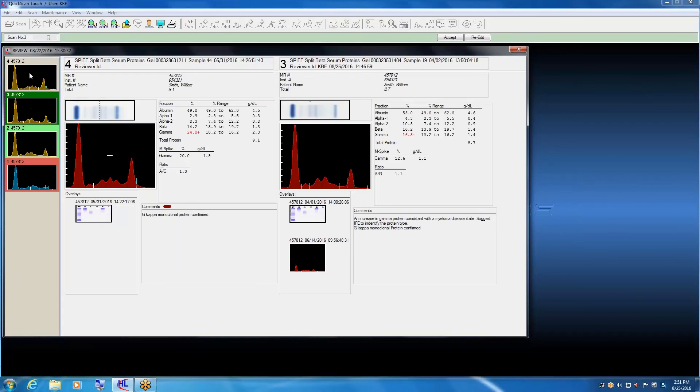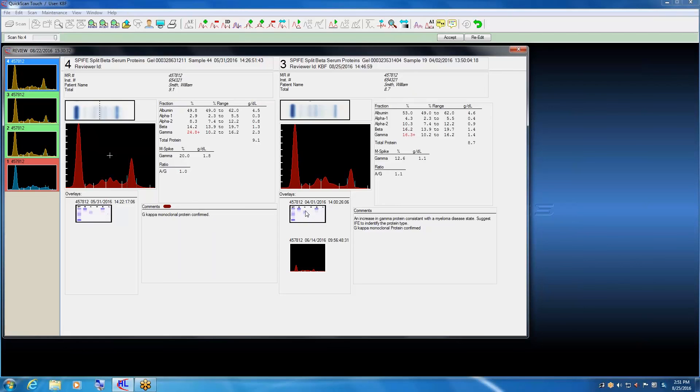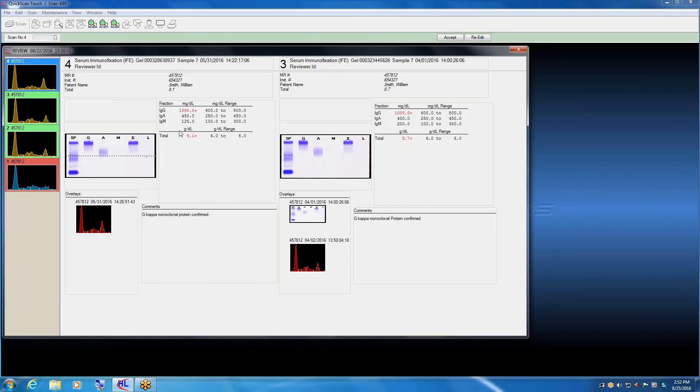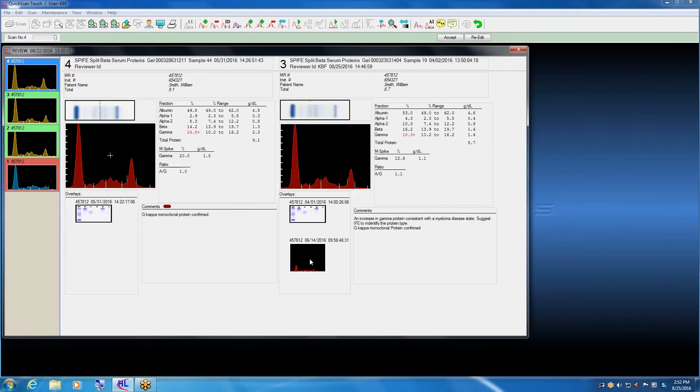They're in order chronologically, is assigned as the baseline sample with the reviewer ID and each historic sample likewise. So here, the pathologist or whoever is doing a reviewing can look at all the patient's data. I've already indicated we can look at the IFE, but how about we compare IFEs? So with just a simple click of the mouse, now the pathologist is viewing all of this data, immunoglobulin data included, for the IFEs. If there were urine proteins done on these samples, we could also compare urine protein to urine protein with all the values associated with that urine protein, and we can then slide right back to our monoclonal protein.